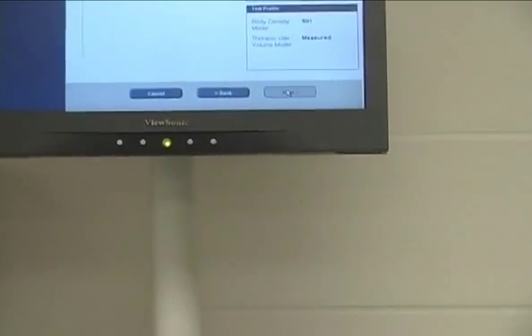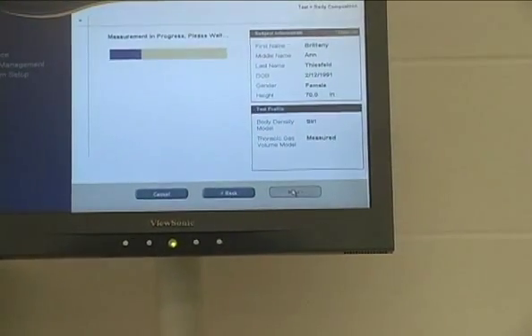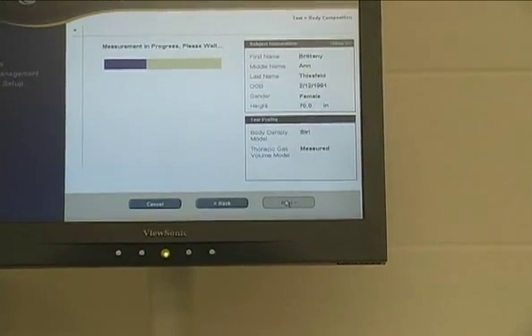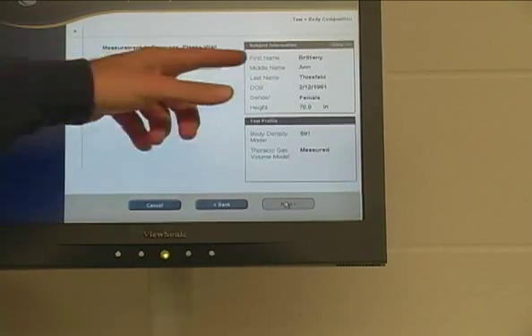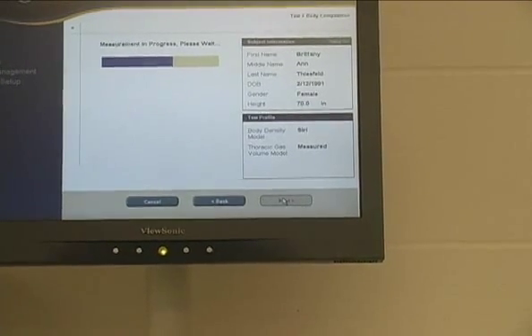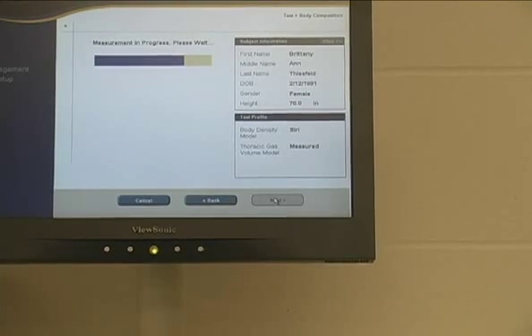So this is the second volume test. They're each about 50 seconds. Anytime you see this going across the screen, it's 50 seconds, whether you're doing some quality control, whether you're measuring a cylinder. So really, of the 5-minute test, subject involvement is less than 2 minutes.